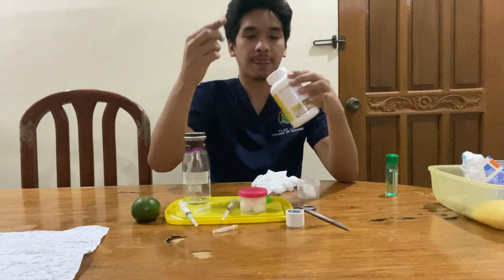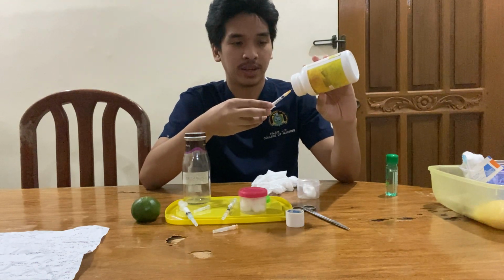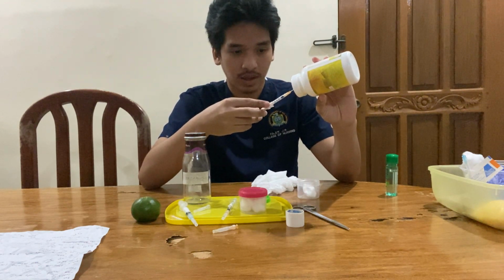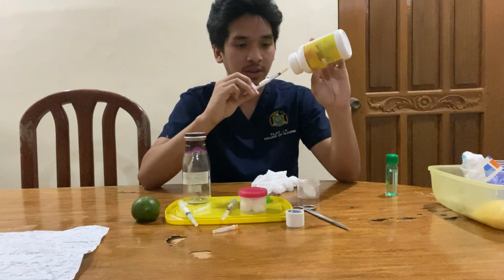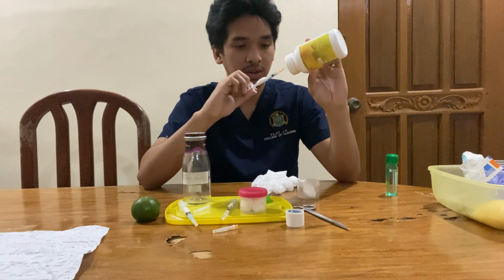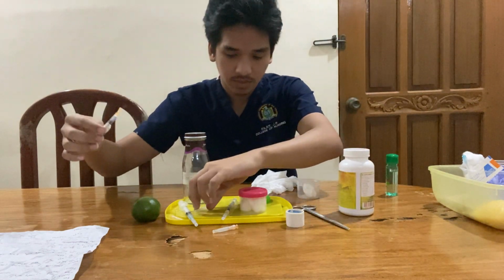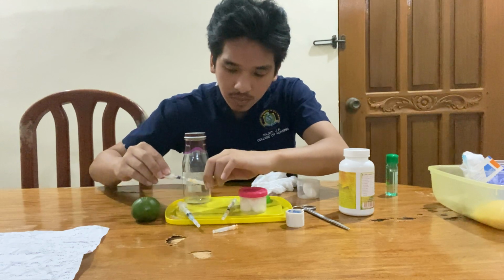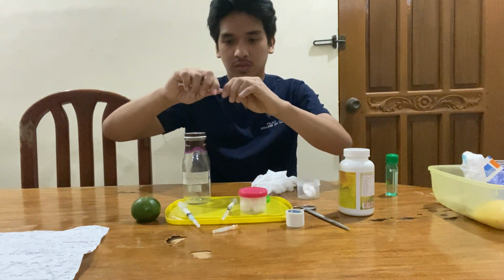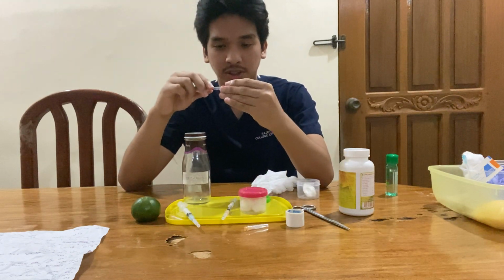Now we will get the medicine. The doctor ordered 0.3 ml of insulin. Done. Then replace the cap again for injection.